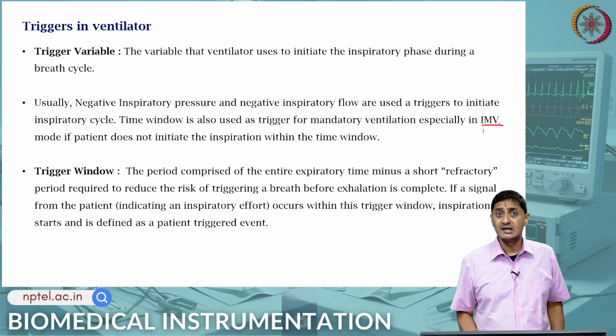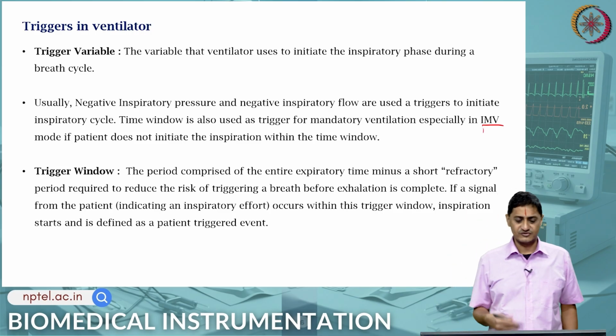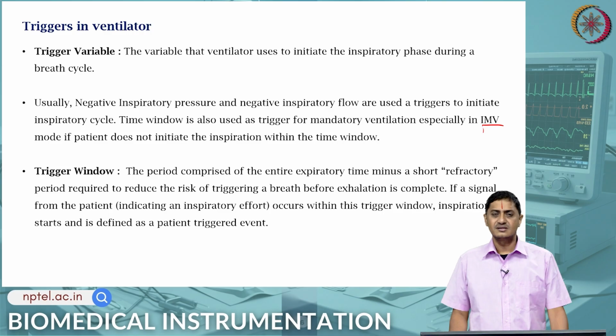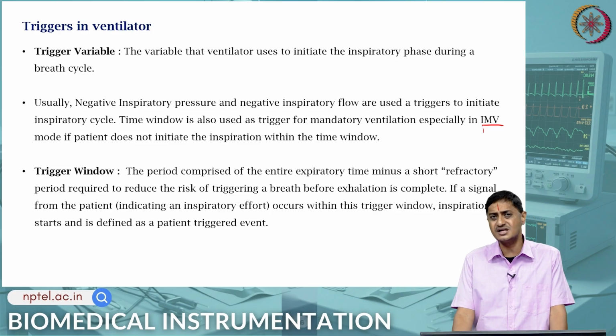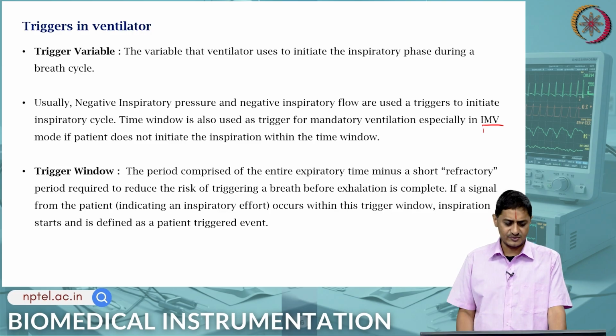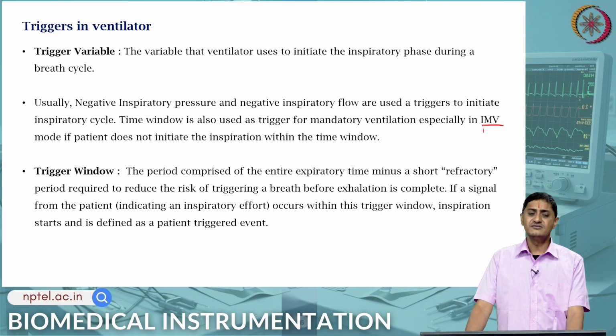What is the other mode? Continuous mandatory ventilation mode, of course, the CMV mode. Then there is the CSV mode, which is continuous spontaneous ventilation mode. Check all these things. If the patient does not initiate, then the mandatory breath is provided. Then the trigger window.